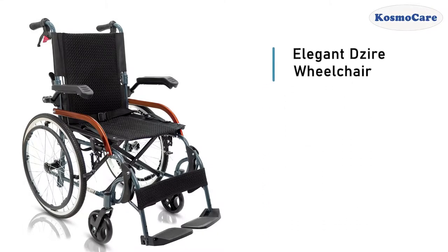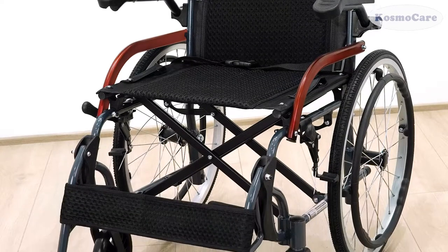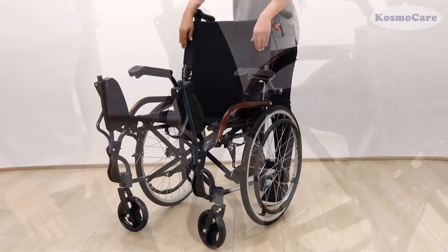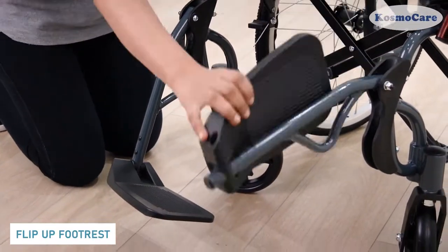CosmoCare Elegant Desire Wheelchair offers a durable and dependable mobility solution to users to support independent living. The wheelchair comes pre-assembled. Simply push down on the sides of the seat and lift up the backrest until you hear a click sound. Flip down the footrest to unfold the wheelchair.